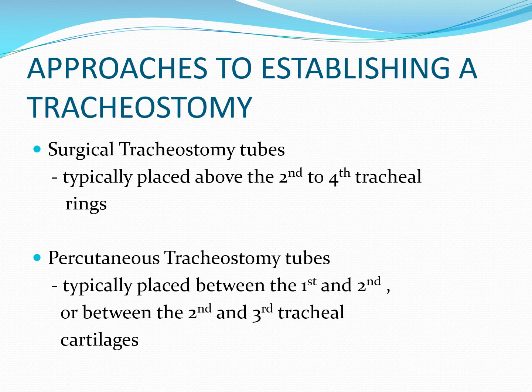Either an ear, nose, throat physician or an attending physician, a surgeon, will be at the bedside or in the OR, and will make an incision, again, above the second, third, or fourth tracheal ring.